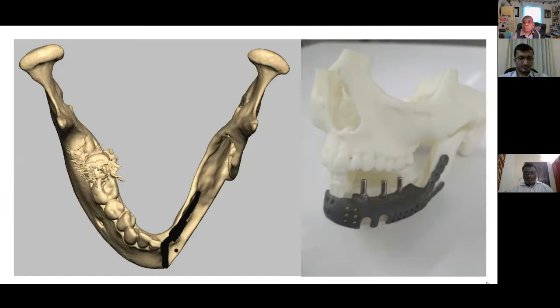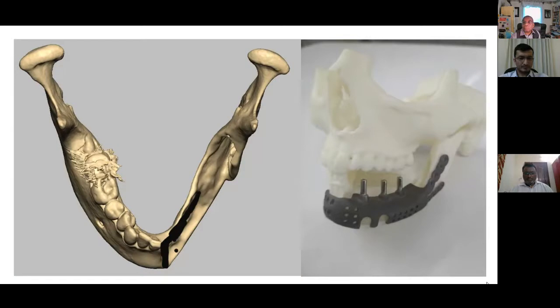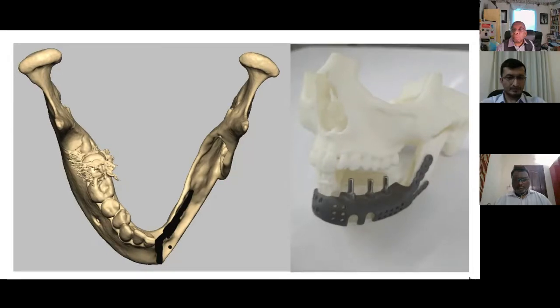In the previous case, if there is an exposure, it being a tubular process, I have to remove the entire one. Maybe I can try a couple of times repositioning the flaps, all that under local anesthesia, all that fine. But still, if there is a time wherein I have to remove it, then that segment entirely goes off. So a new process has to be designed, suboptimal, again height, everything comes into play. In this particular scenario, even if there is a chance of exposure, I could only cut the process and avulse it buccally, retaining the periosteal pouch, and keeping that newly formed cancellous bone abutting the lingual osteoperiosteal flap, the lingual cortex.